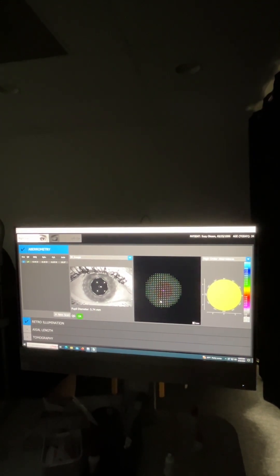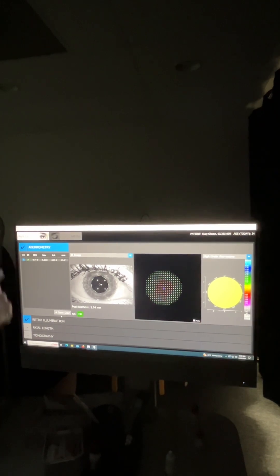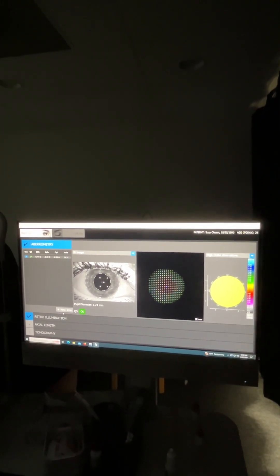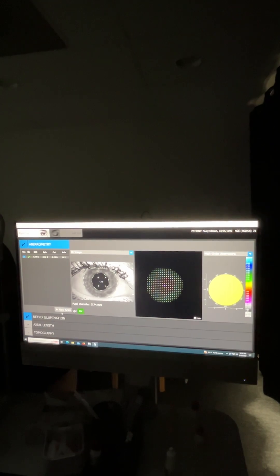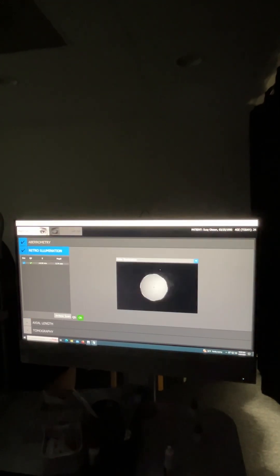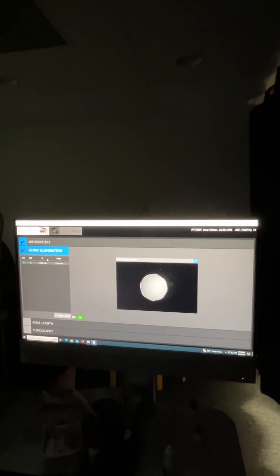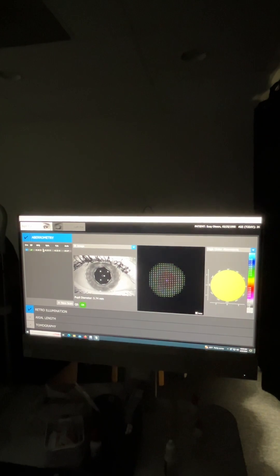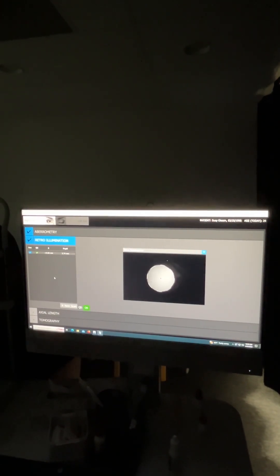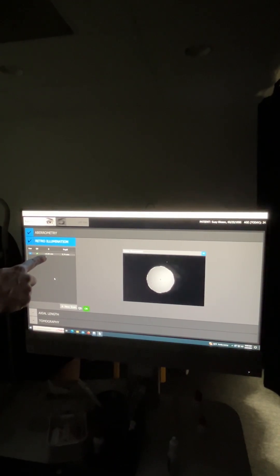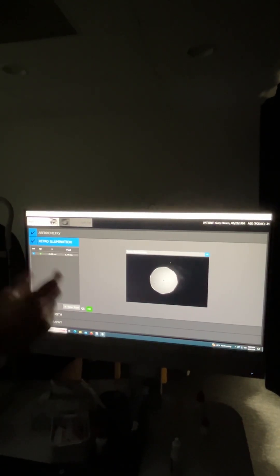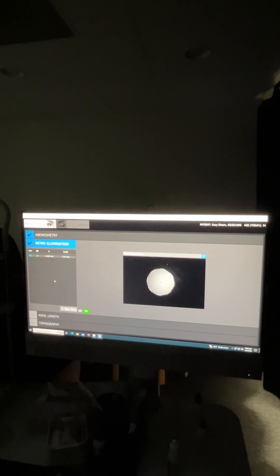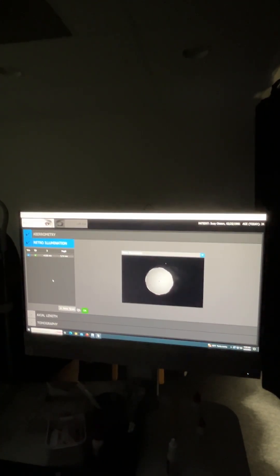So all that looks good. Now at the same time that it did the aberrometry, it also took the retro illumination. So you don't have to necessarily do that twice. It'll do both of those tests at the same time. You do want to check retro illumination and verify that you have a nice image. If you didn't have a nice image or if you had a blink, you can repeat only this portion without repeating aberrometry. Now in hers, it came out great. Again, it's going to give you basically your angle kappa information, and it's going to give you the size of the pupil, which is basically going to be a scotopic pupil.